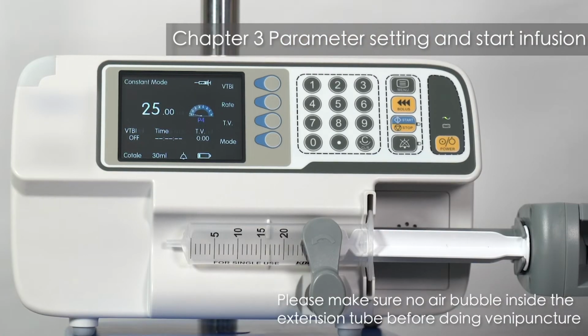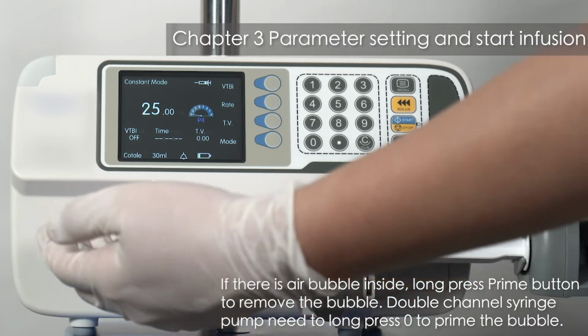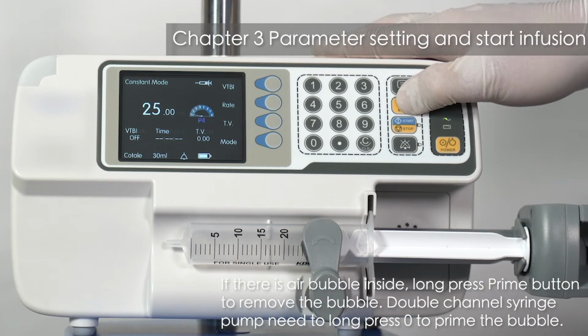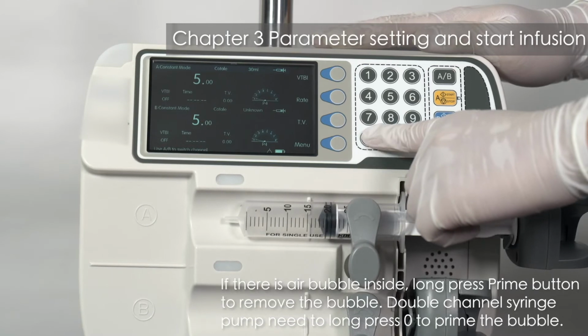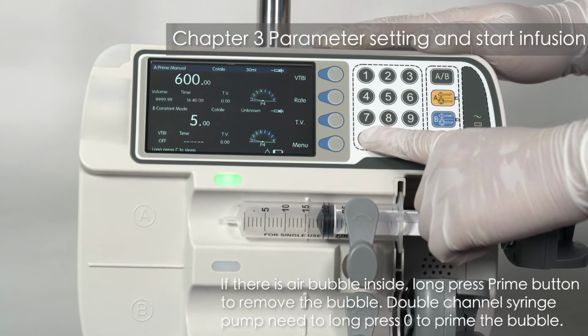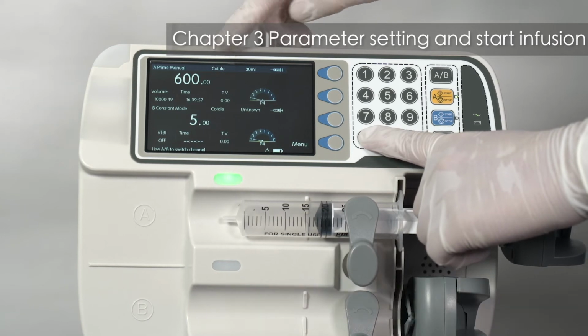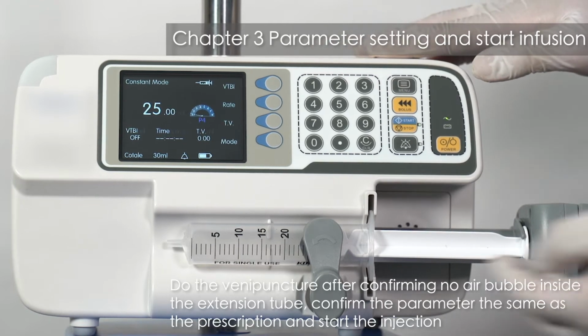Please make sure no air bubble inside the extension tube before doing venipuncture. If there is air bubble inside, long press Prime button to remove the bubble. The double channel syringe pump needs to long press 0 to prime the bubble. Do the venipuncture after confirming no air bubble inside the extension tube.